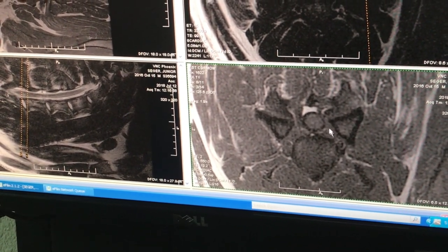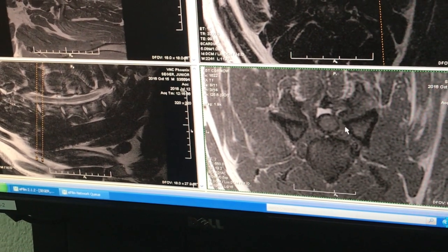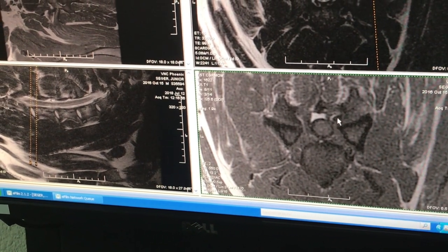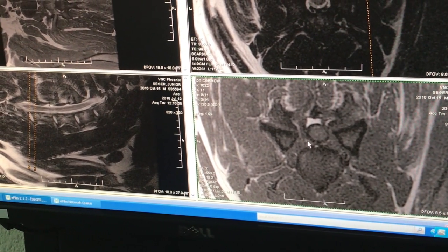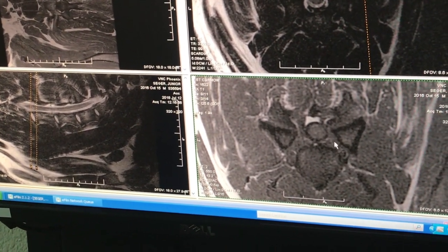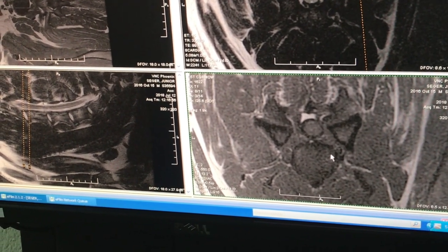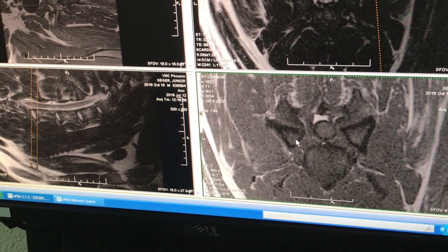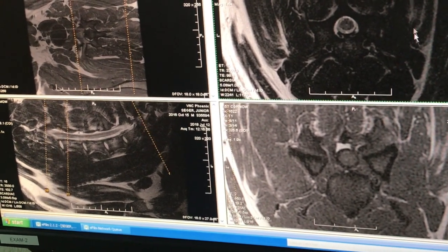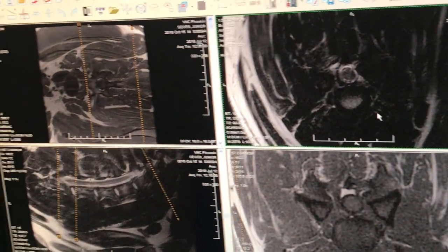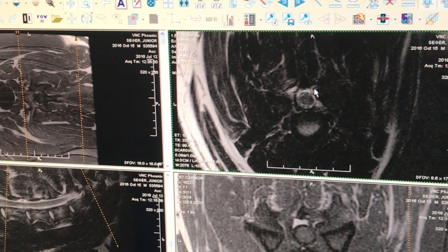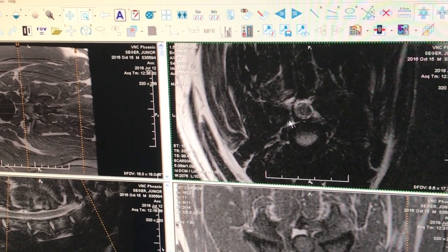Here's where you can really appreciate that there is stenosis — we only have the nice white fat here, and there's just not enough space. This is where the bones at the articulation of the fourth and fifth vertebrae have proliferated or become larger, and they're starting to compress on the sides of the cord. Here is also where the nerve root exits on the right side, and this opening is a little bit smaller compared to the other side, which could also be a source of pain. On a different image type you can also see the change on the right side compared to the left — there's just less space.